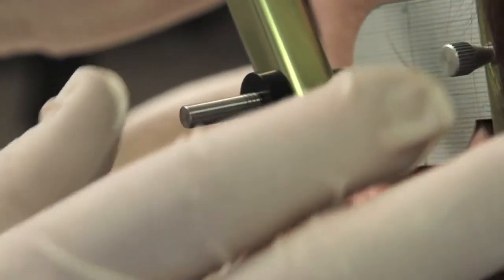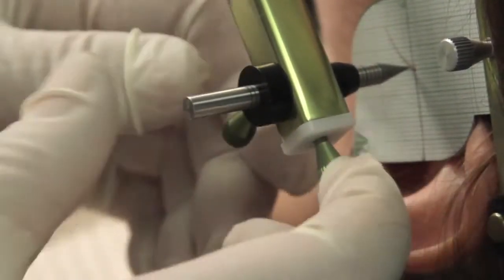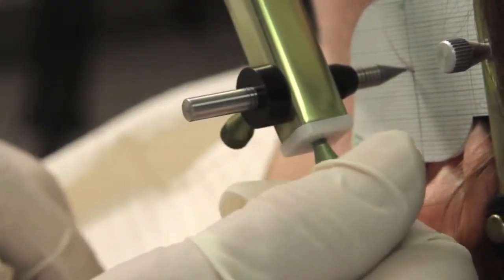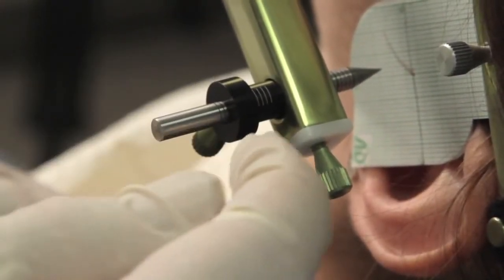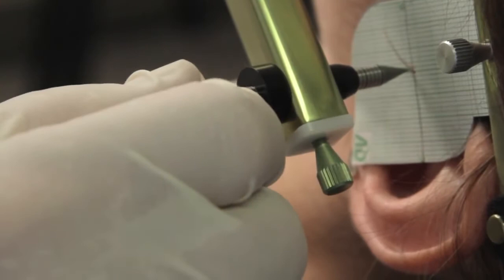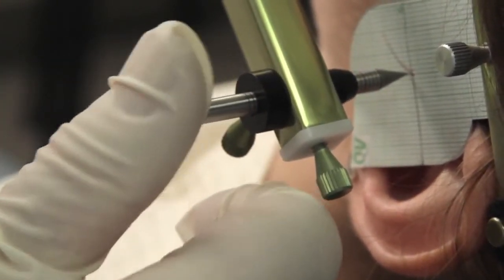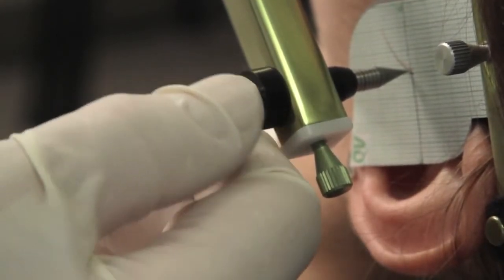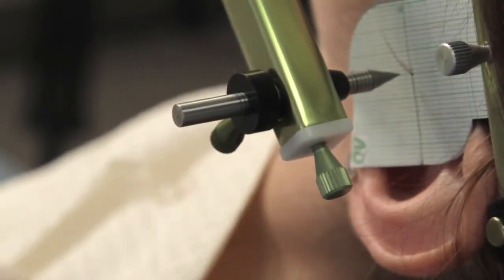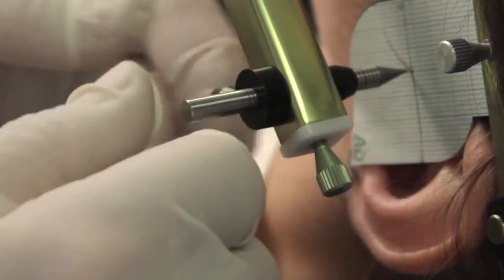Now there's one other way. Sometimes it might work better to use another approach to measure an immediate side shift, and that is using the bullet to measure it. If you look here, you can see on the bullet that there are millimeter marks also. The first mark is the 0 mark. When the bullet is all the way in against the sidearm, that's the 0 mark. So any movement that it moves away like that is how much side shift there is. And so we'll do it using the bullet technique.